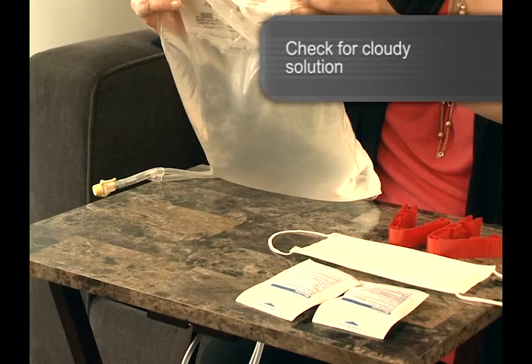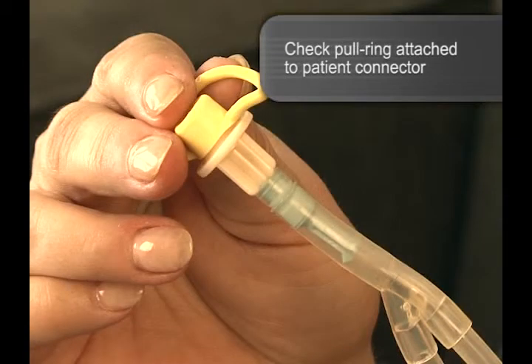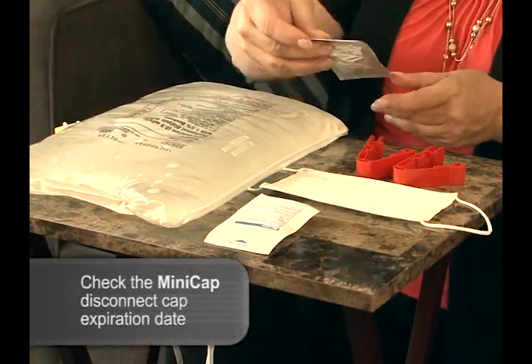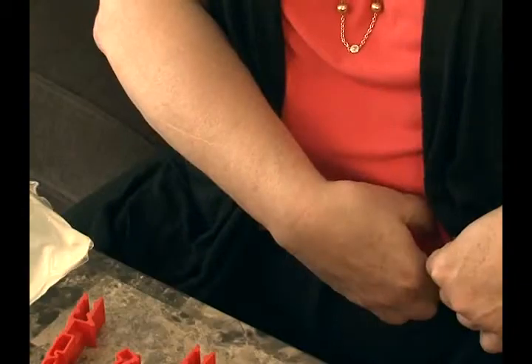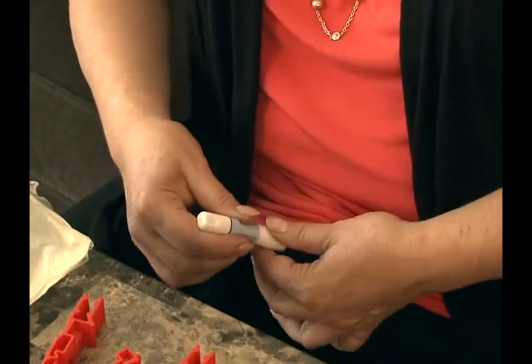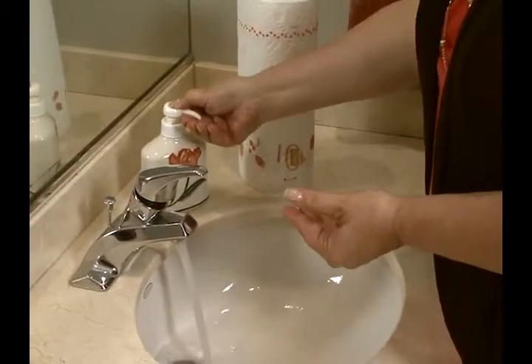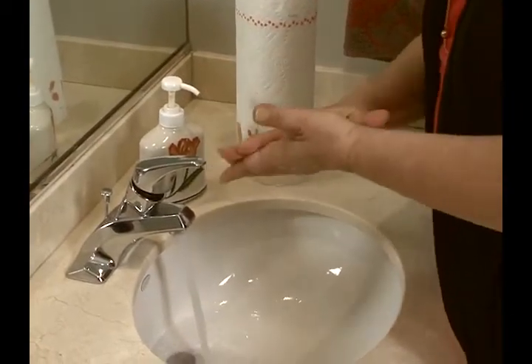Discard the bag if the solution is cloudy. Next, inspect the patient connector to ensure that the pull ring is attached. Do not use if the pull ring is not attached. Finally, inspect the new MiniCap disconnect cap for the expiration date. Next, remove the transfer set from your clothing. Make sure the transfer set is closed. Put on your mask and then wash your hands. These are important steps in maintaining aseptic technique.